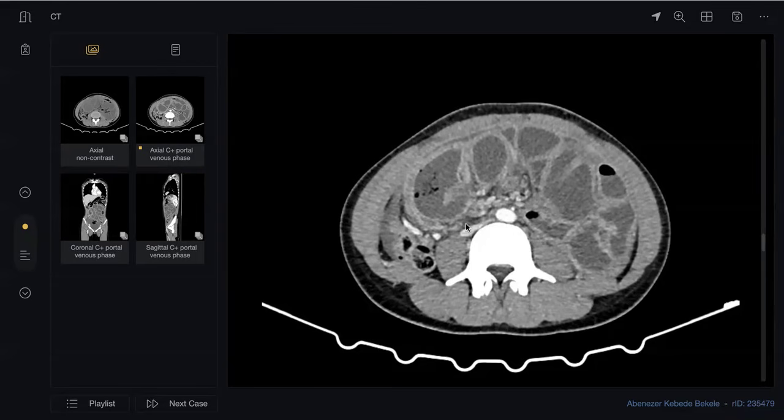How will you differentiate it from the internal hernia? In internal hernia, there will be a swirl sign, swirling of vessels. Okay, you did good. You made that final diagnosis of cocoon that very few people are able to make. Don't go anywhere, please. Just leave your mouse.